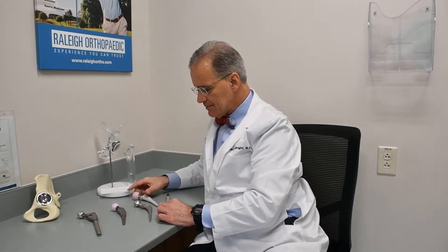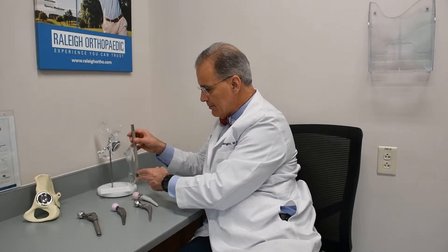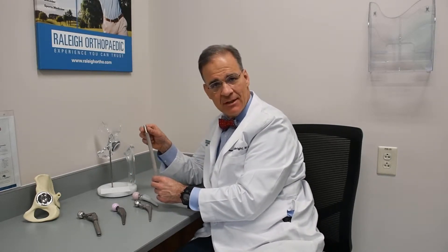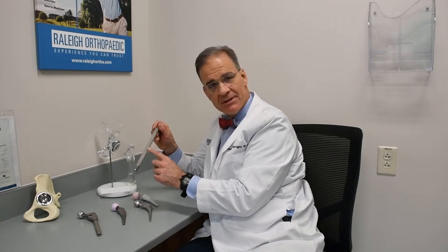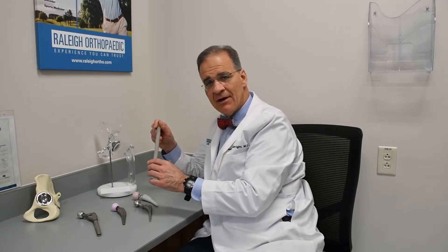I wanted to go into the different types of shapes. This would be an example of a stem that would go down the femur for a redo, a revision, a complicated surgery. This has sandpaper-type material, porous coating on it — the bone grows into it. Very, very effective.